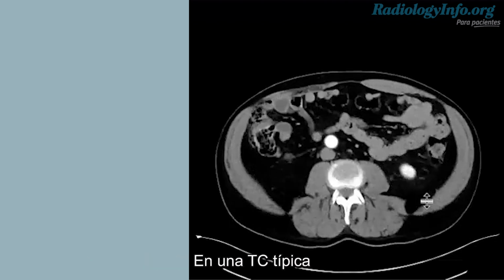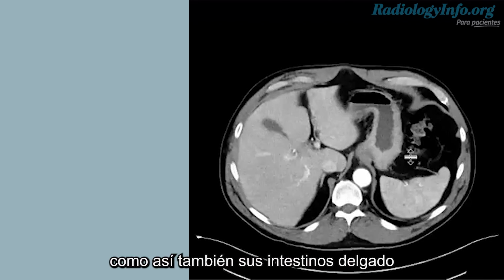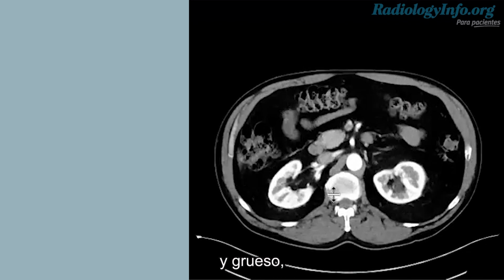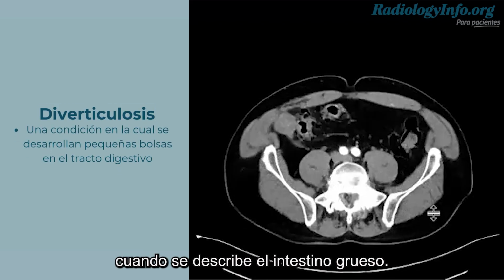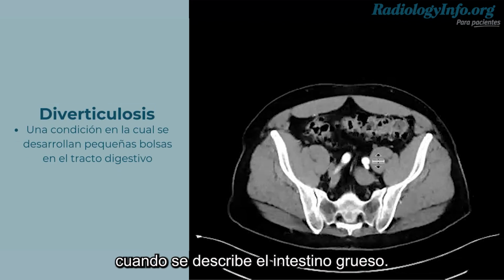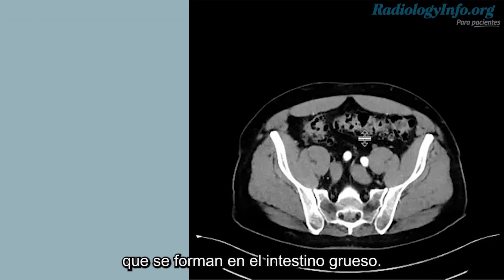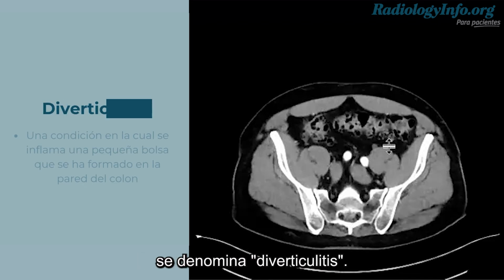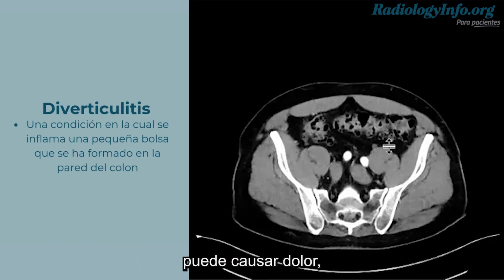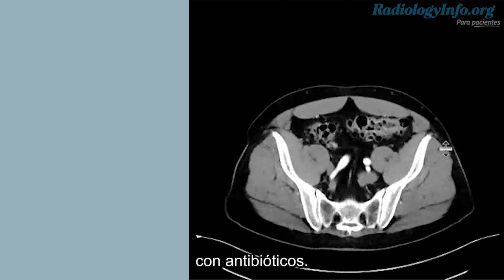In a typical CT of the abdomen and pelvis, we'll also be able to see your stomach, as well as your small and your large intestines, which you see here. You may see a term called diverticulosis when describing your large intestines. This is simply small little gas-filled outpouchings that form in the large intestines. You can see them right here. They're usually of no harm, but when they get inflamed, it's called diverticulitis. And when that happens, it can cause pain, fever, and often needs to be treated with antibiotics.